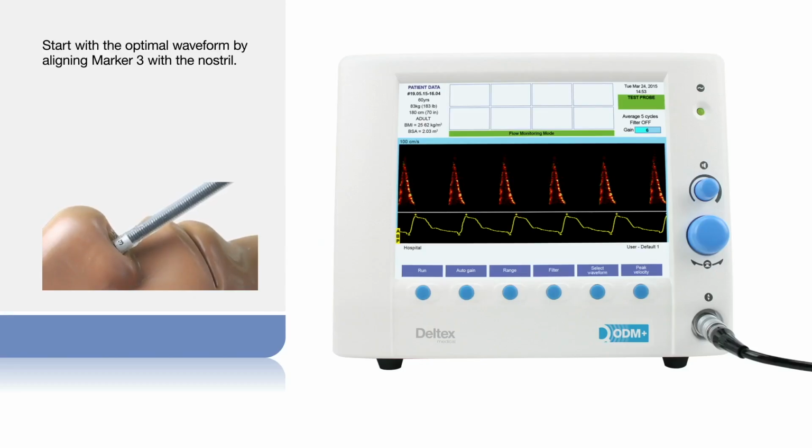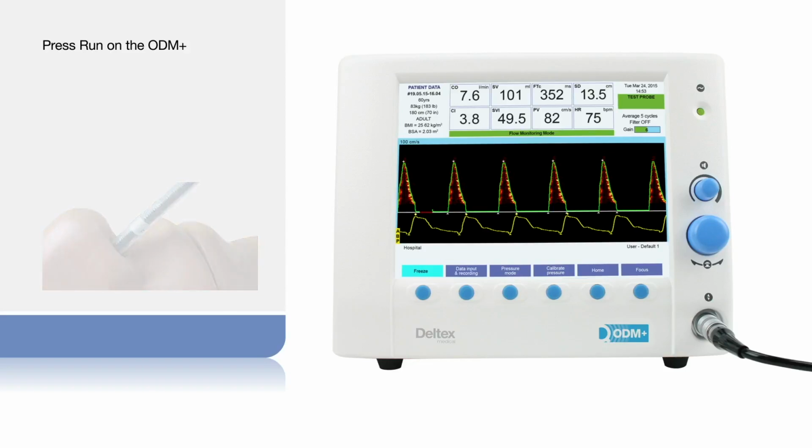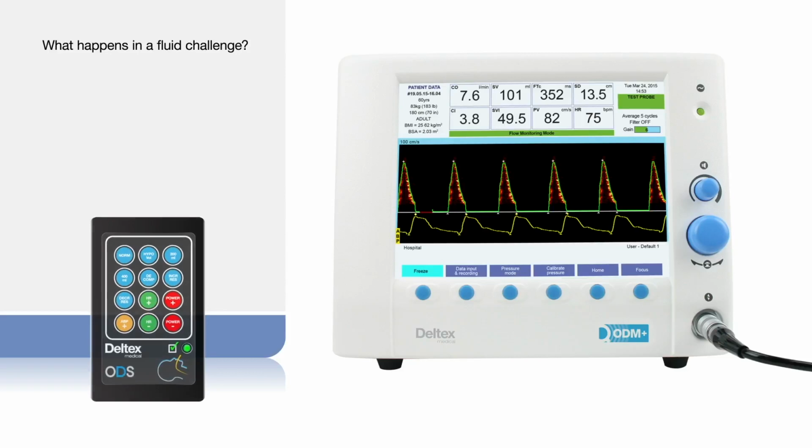Start with the optimal waveform by aligning marker 3 with the nostril. Press Run on the ODM+, and once the green line follower is in place, the flow parameters can be calculated. Now let's look at what happens in a fluid challenge.